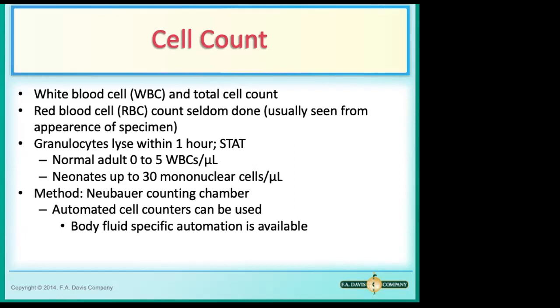It's hard to use electronic cell counters because there's a lot of background counts, and this method has traditionally been a manual method, and it's still counted this way now. Even though it's not the easiest procedure, it's still the standard procedure for counting the cells in the CSF.